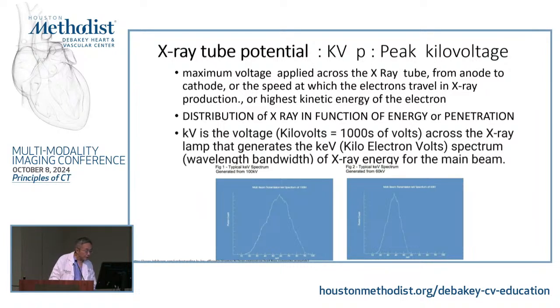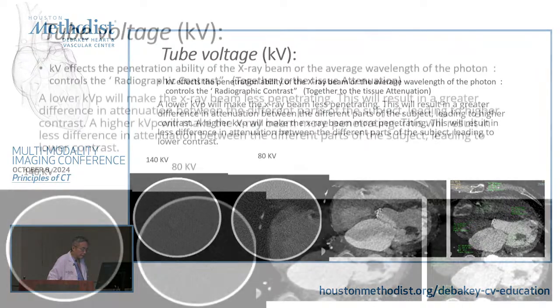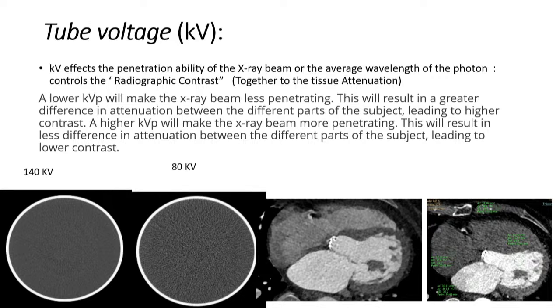Okay? So you can see here, that's the main difference that I want you guys to understand. With kV, you have control, right? With keV, what's generated is very standard, so you can expect what kind of energy spectrum you're going to see after you apply that kVp. Okay? As you can see here, it's similar, right? I mean, if you have higher kVp and lower kVp, okay? With lower kVp, you're going to see more noise.